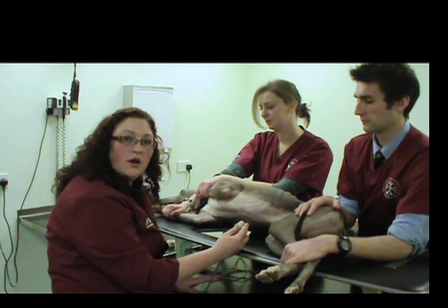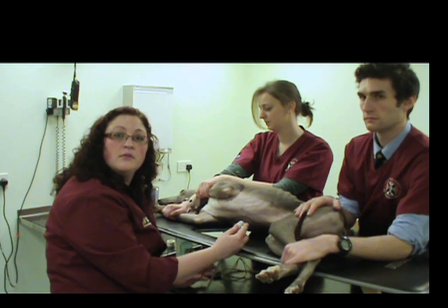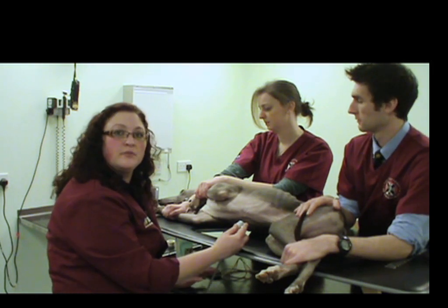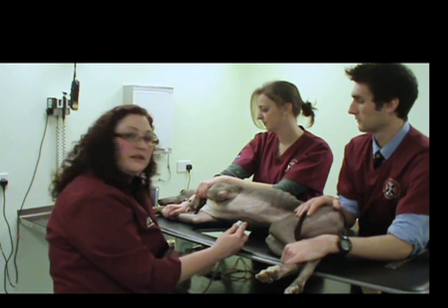Now we will obtain the right parasternal short axis view at the level of the mitral valve leaflets, also called the fish mouth view. We've already seen that once, but we'll just obtain that directly now.